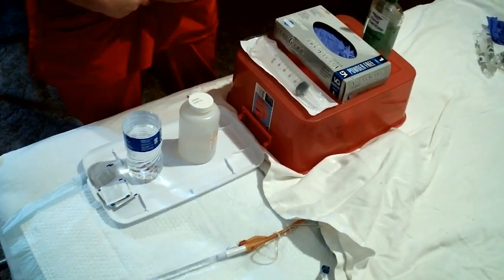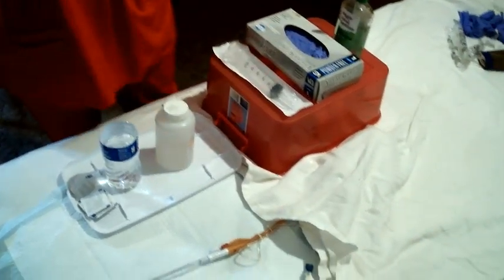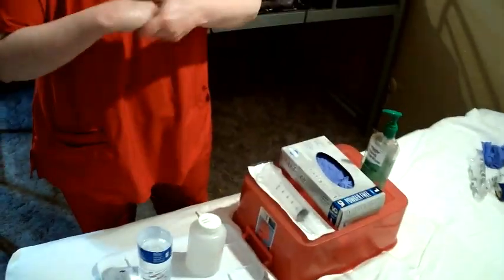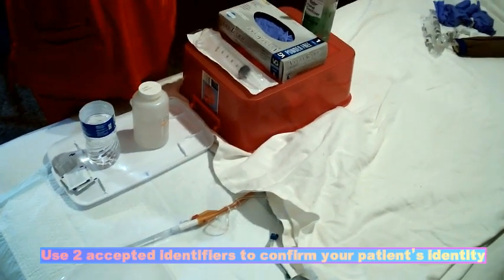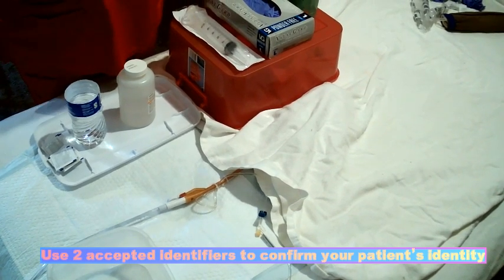You're having a little bit of pain down here? So he's having suprapubic pain. First, I'm just going to do some hand hygiene. Is it okay if I touch your stomach? Yes. Can you tell me your date of birth? February 26, 1962. Okay, just wanted to make sure.